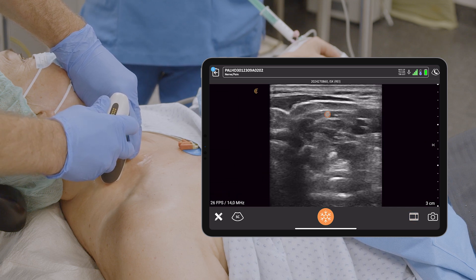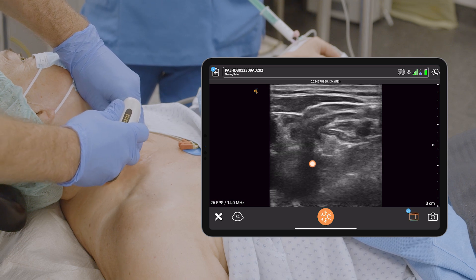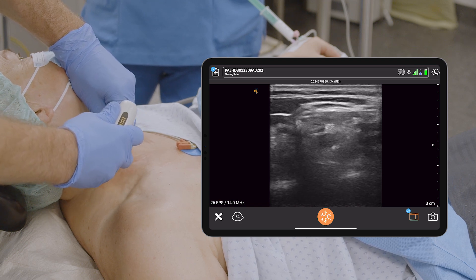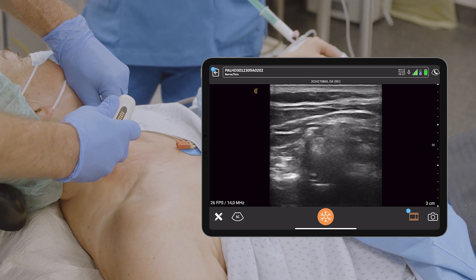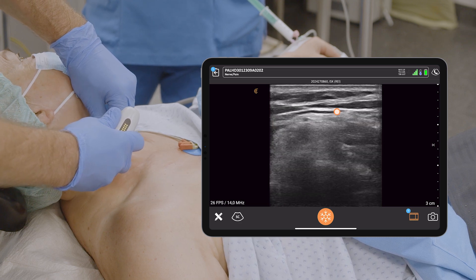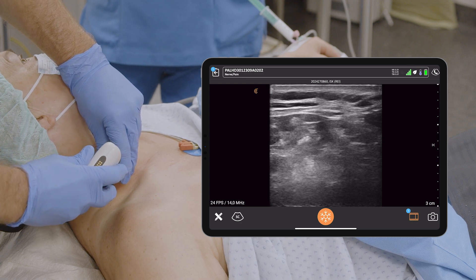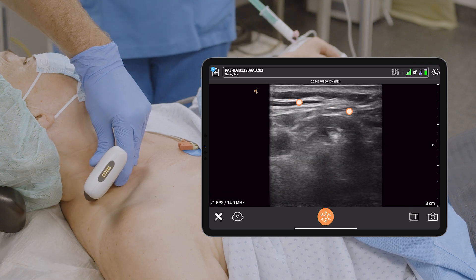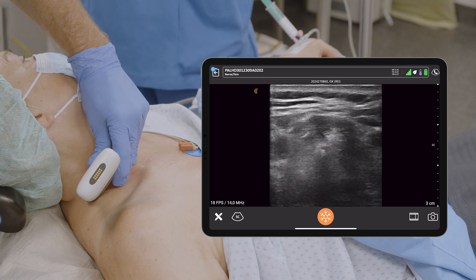We can see the vertebral arteries and veins right here. We've got C7 here, C6 here, spinal nerve C5 here, and even C4 — I can see the bony shadow. I follow the nerve coming out of C4 into the cervical nerve pathway, ending at the posterior edge of the sternocleidomastoid muscle. This is where I will inject the local anesthetic, as I want to anesthetize the supraclavicular nerves too, which are in the center of the image.